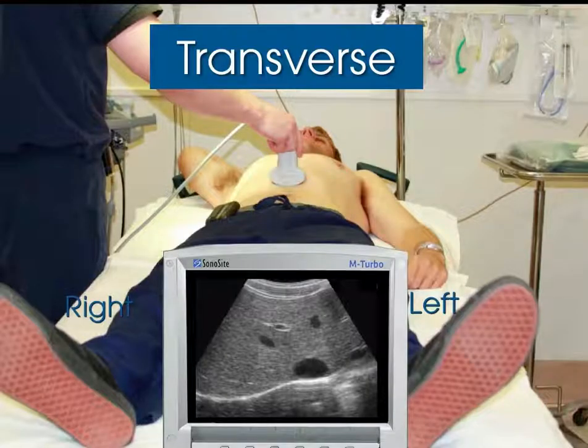Transverse, it's as if we're standing below the patient's feet, looking up towards the body. I've got the indicator towards the patient's right, and the IVC appears as a short axis. It's not unlike reading an axial CAT scan where we have everything over here to the right and everything over here towards the patient's left.